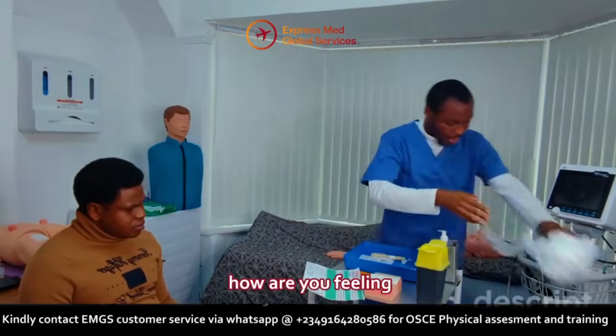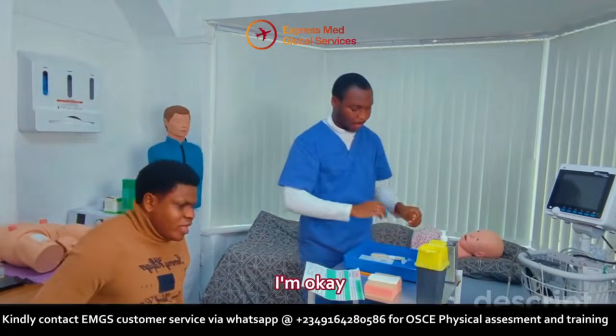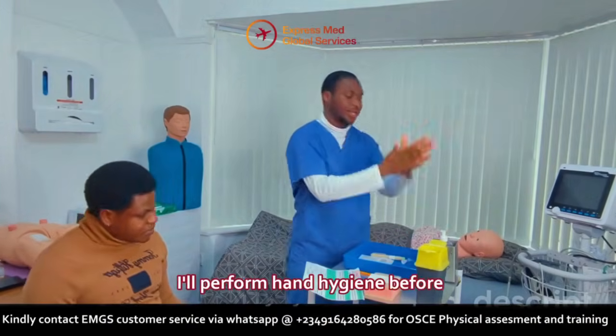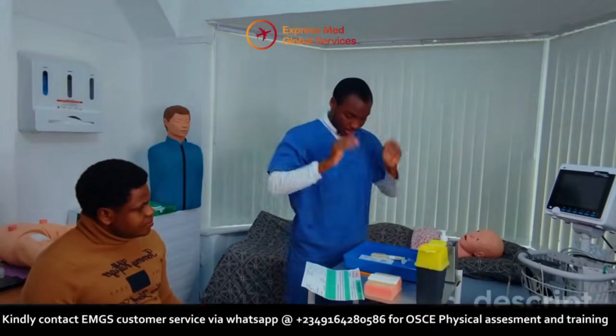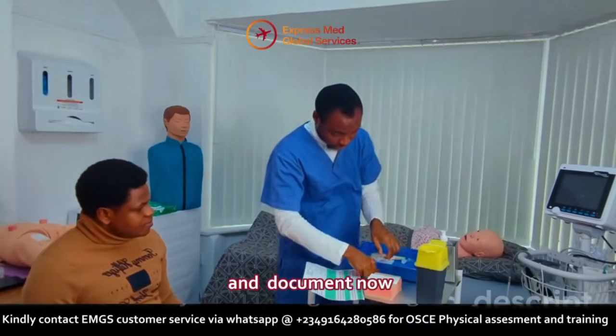Alright, Mercy, how are you feeling? Yeah, I'm okay. I'm coping well. Alright, I'll perform hand hygiene for 30 seconds and I'll document.